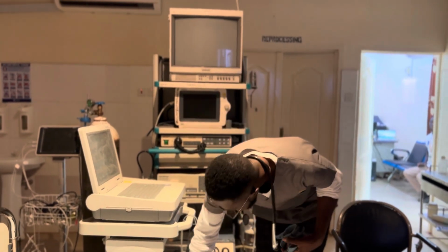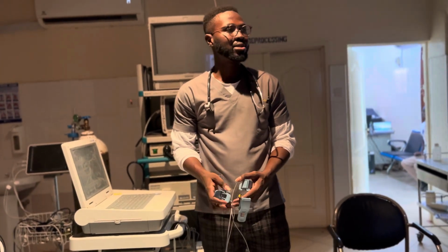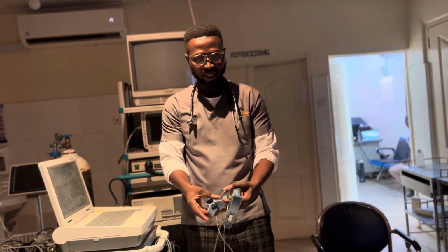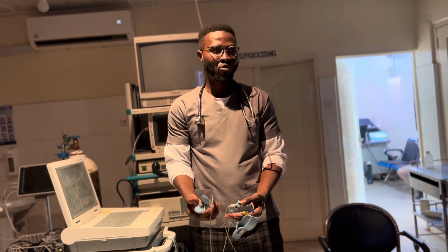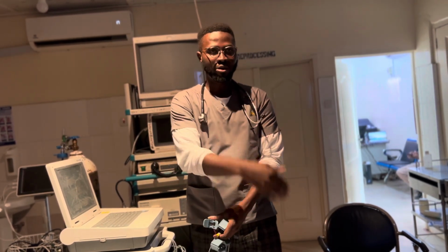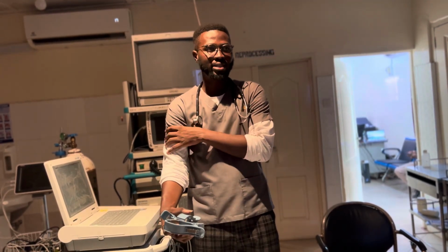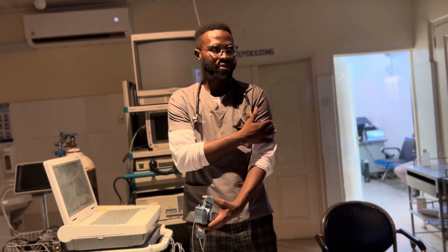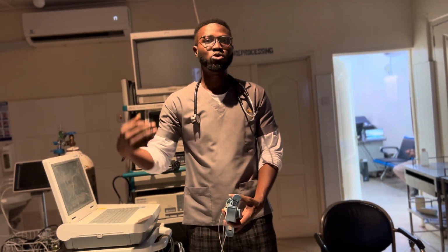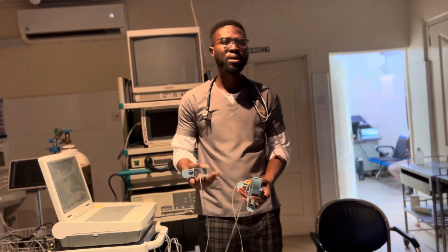These are, yes, 4 of them. These are the limb electrodes. You saw that when we went online and I was teaching ECG, that this can even have community health significance. Where you have the red, I asked you to draw from this. Do you remember? So red, yellow, green, and black. The red would be on the right arm electrode, the yellow would be on the left arm electrode, then the green, and then the black. So that you can just picture how you draw the Ghana flag. Red, gold, green, and then the black in the middle.